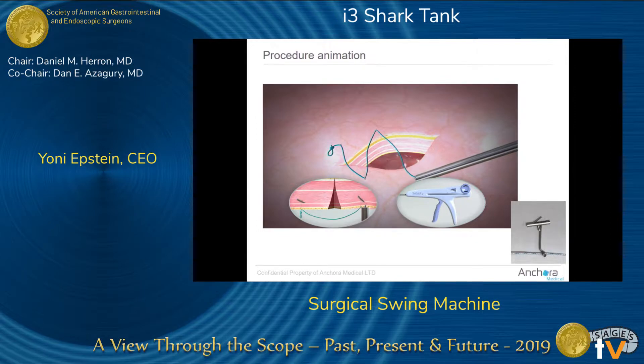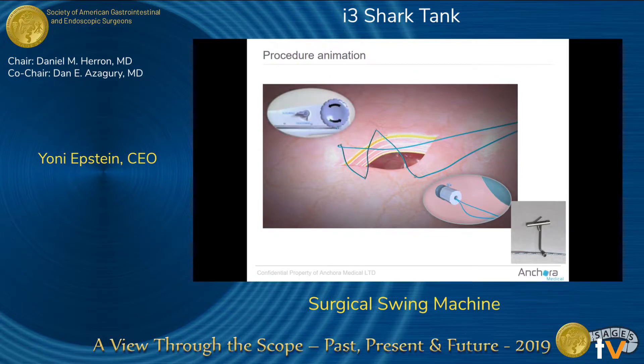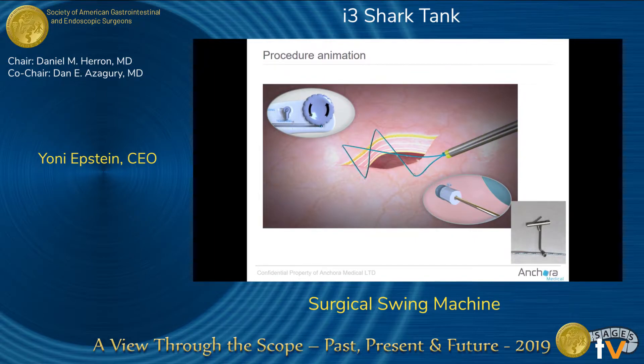Once done, we eject the device out of the abdominal cavity and change it into tightening mode. By doing that, we change the spool into a ratchet. We do a slip knot, assemble a cap — which is basically a knot pusher — and then push it towards the tissue to approximate it.